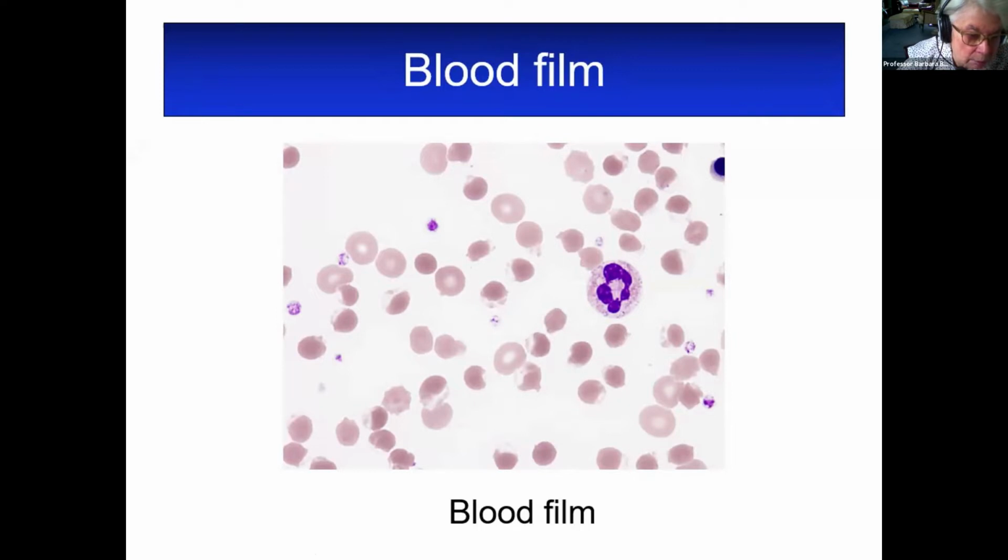But then the other curious thing about them is that a lot of them have got some empty cytoplasm. And these are often called blister cells, or if this empty cytoplasm occupies half the cell, then you can call them hemighosts. But there's an even more intriguing finding, which many people are unaware of, and that is that within this empty area, there are some inclusions. So this is the best example here. And there's a small one there and a couple of little ones there. And you can see things that appear to be sticking out of the cells, as in this one.